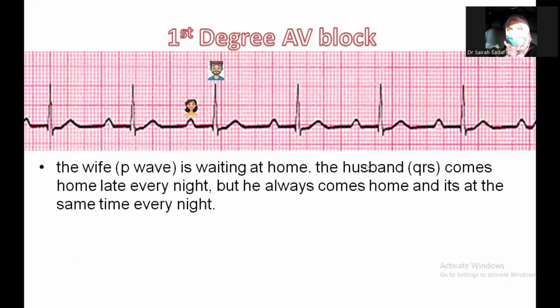But the time is fixed, and there is something wrong. The wife is waiting at home. The husband QRS complex comes home late every night, but he always comes home at the same time every night.